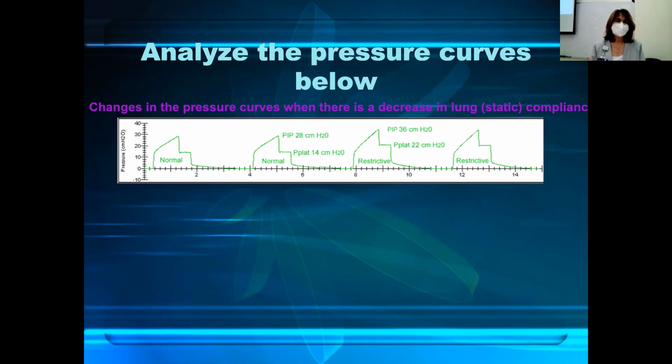All right, so this is showing one of the first graphics, and over here it says pressure in centimeters of water. So when a ventilator breath goes into a patient's lungs, the ventilator keeps track of the amount of pressure that's building up, and then it shows it to you on a graph. So in green, you see the pressure is building up during inspiration. And when it hits the highest pressure, you notice that it drops.